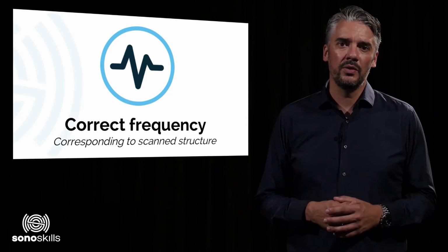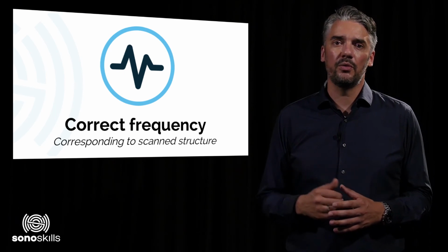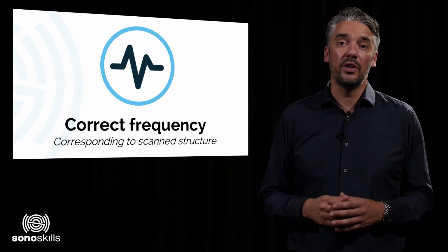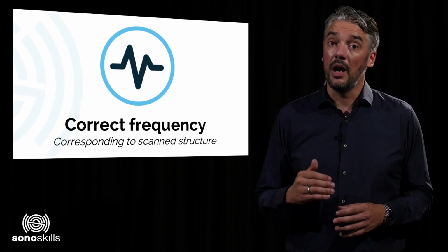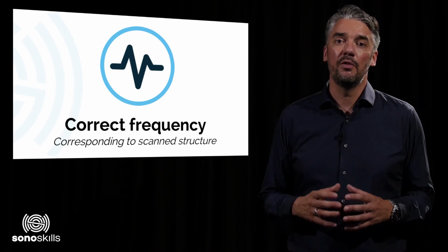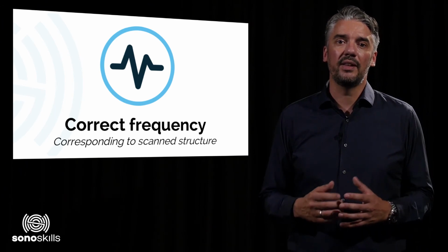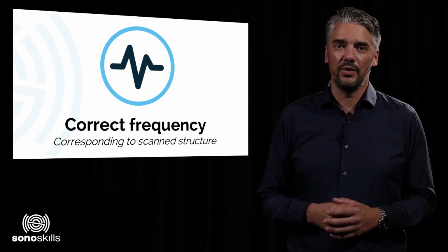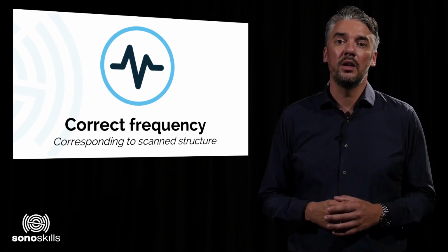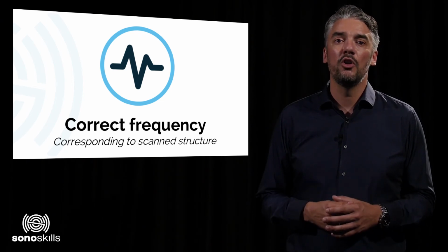Higher frequencies are used for the resolution of more superficial structures, and lower frequencies are used for better tissue penetration. There are no hard and fast rules regarding the precise frequency for each specific depth, as it can vary due to a number of factors, including tissue thickness. A general rule is that the highest frequency that provides adequate tissue penetration and visualization should be utilized.